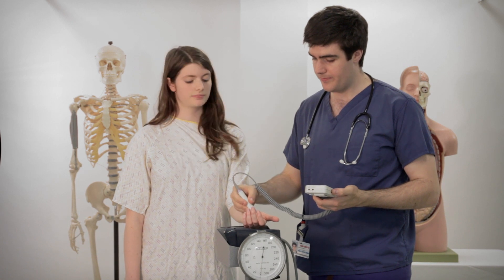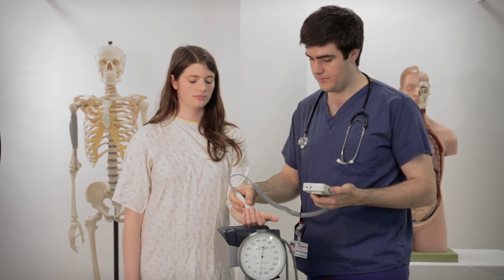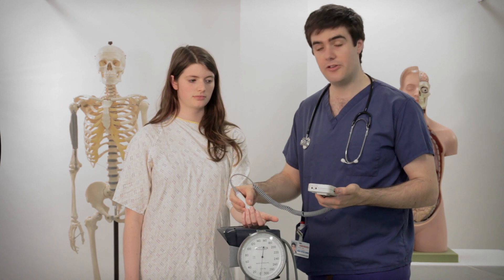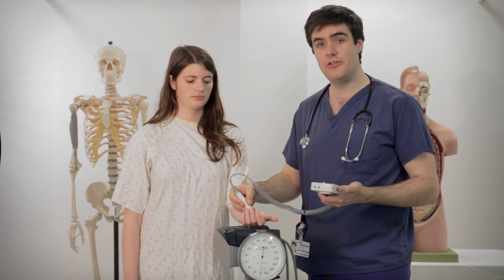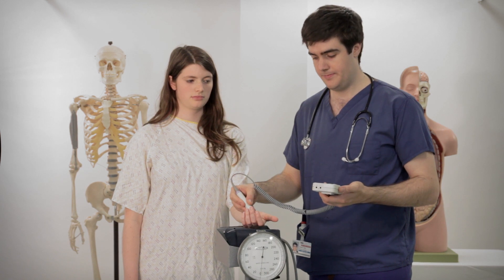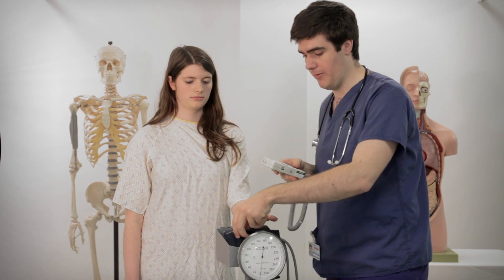So I turn it on. You should be able to hear the pulse of blood as it goes through the artery in Sophie's wrist. So that's normal and what it should sound like — that's a regular pulse.